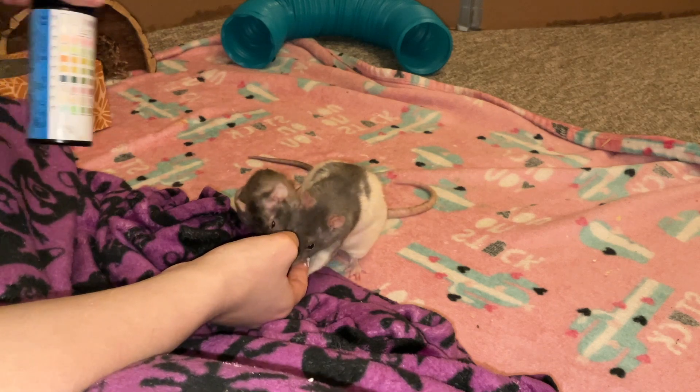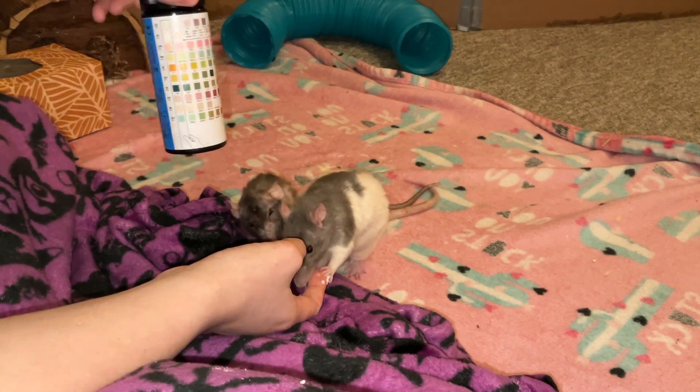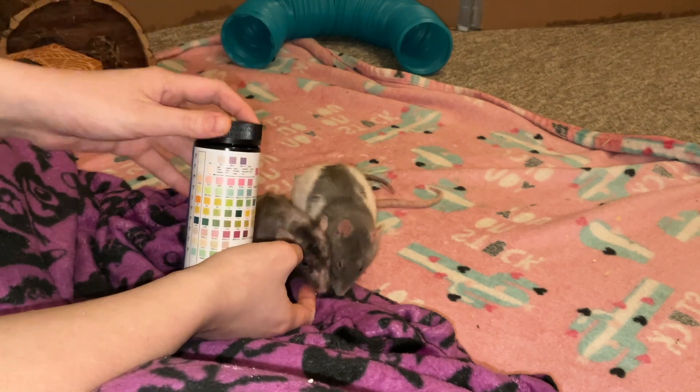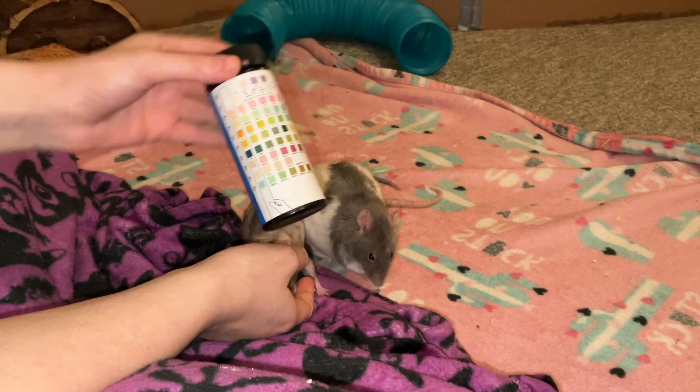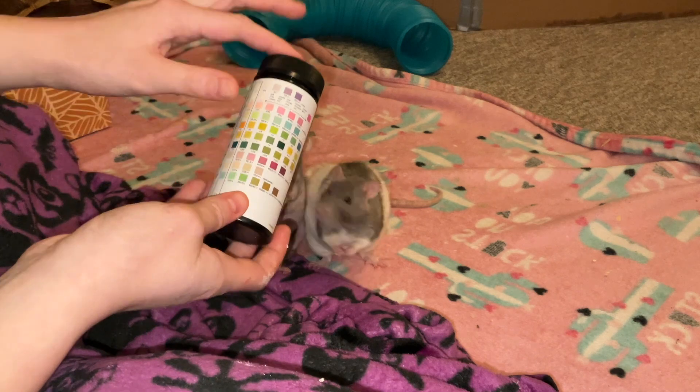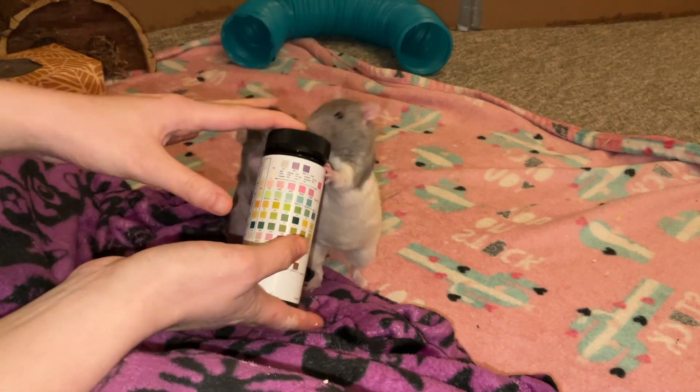Hey guys, it's Shadow the Rat, and for today's video I want to show you how you can do a urinalysis test on your rats. Having some urinalysis strips is super important for your rat first aid kit, because these can help alert you to a lot of issues going on in your rats.